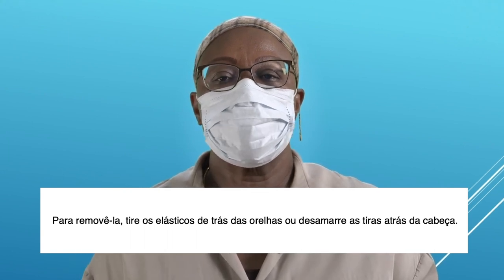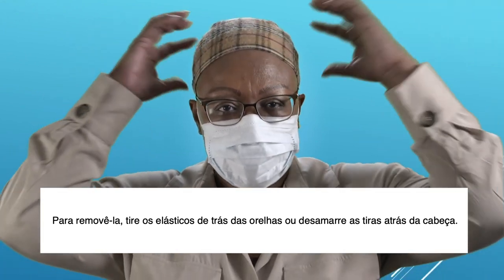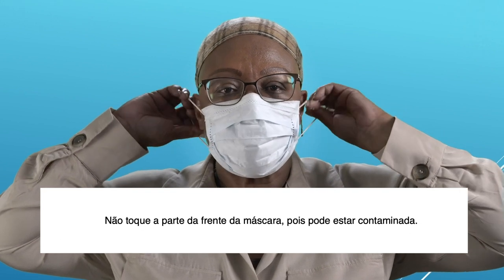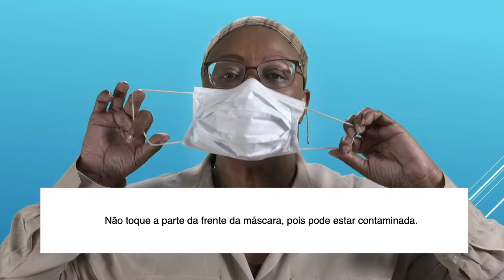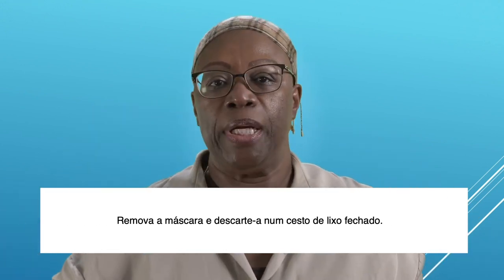To remove the mask, take the elastics from around your ears or untie the strings behind your head. Do not touch the front of the mask, as it may be contaminated. Remove the mask and discard it in a closed bin.